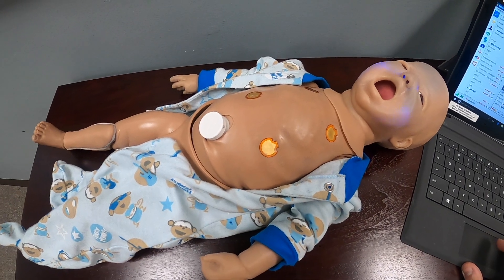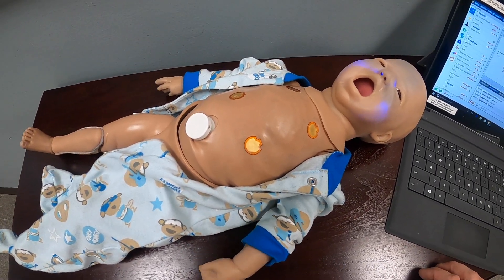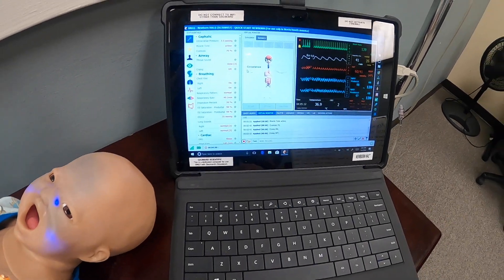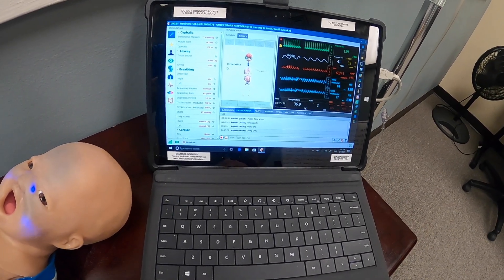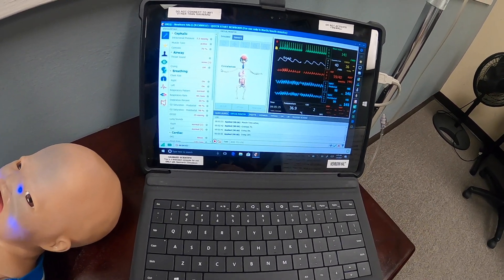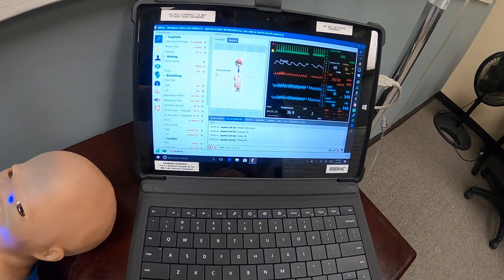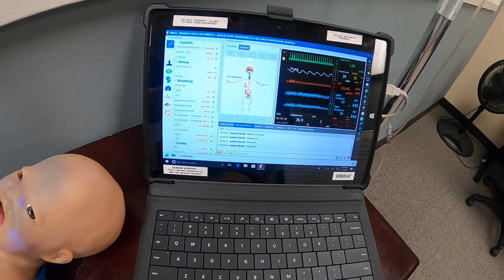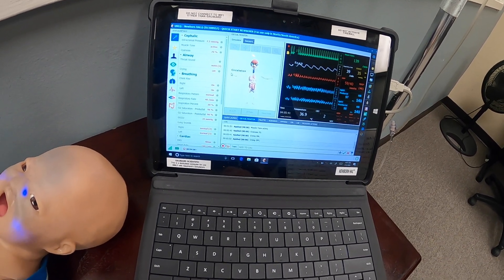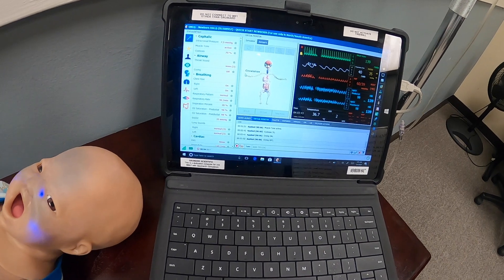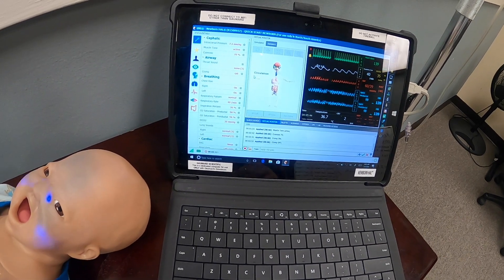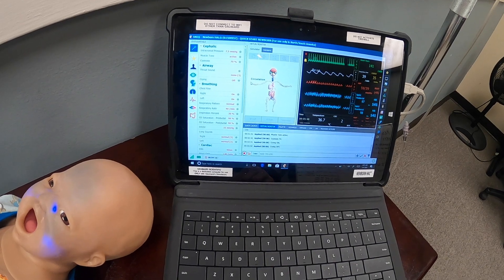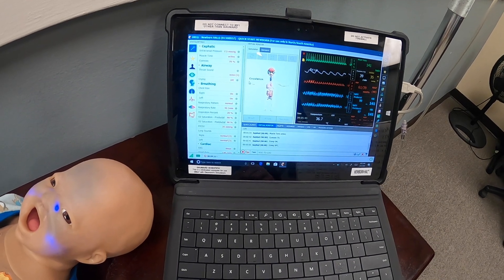This is another high fidelity mannequin that is used with this program. The instructor can monitor the students throughout, noting good points, bad points, and areas for improvement. At the end of the simulation, the student is able to review the scenario, go over it with the instructor, and improve from there.